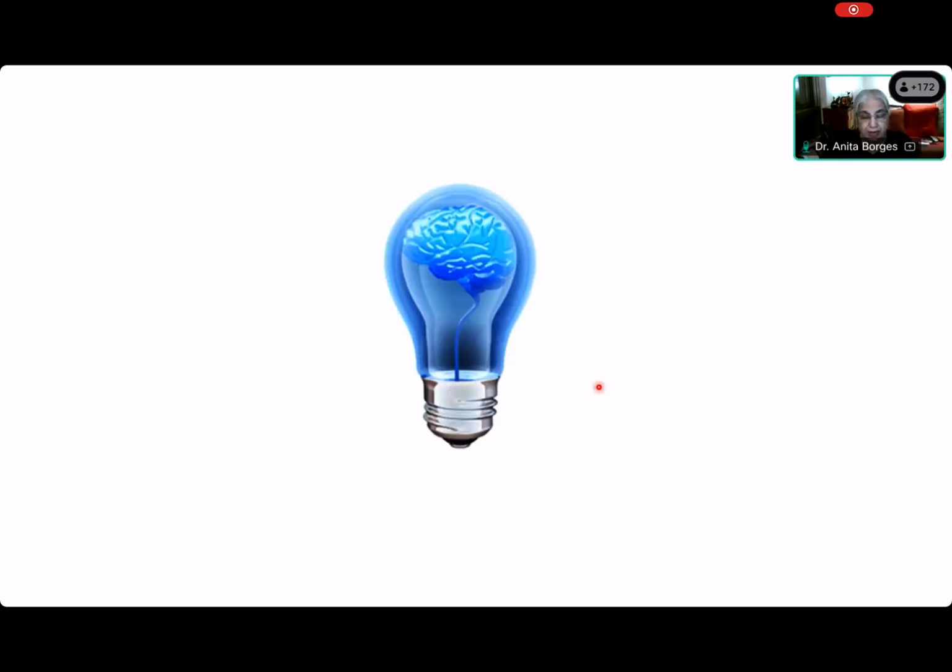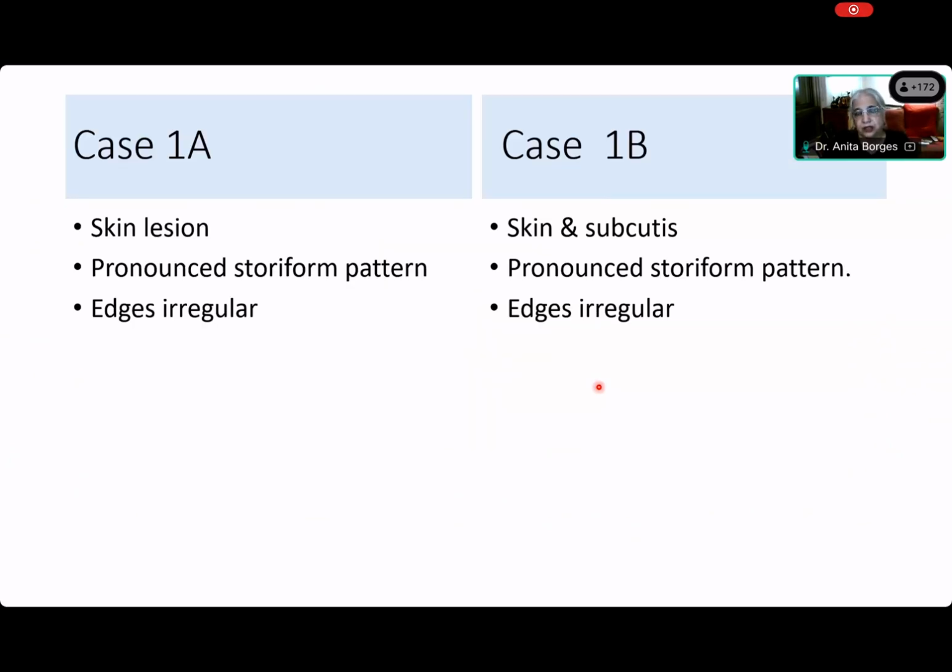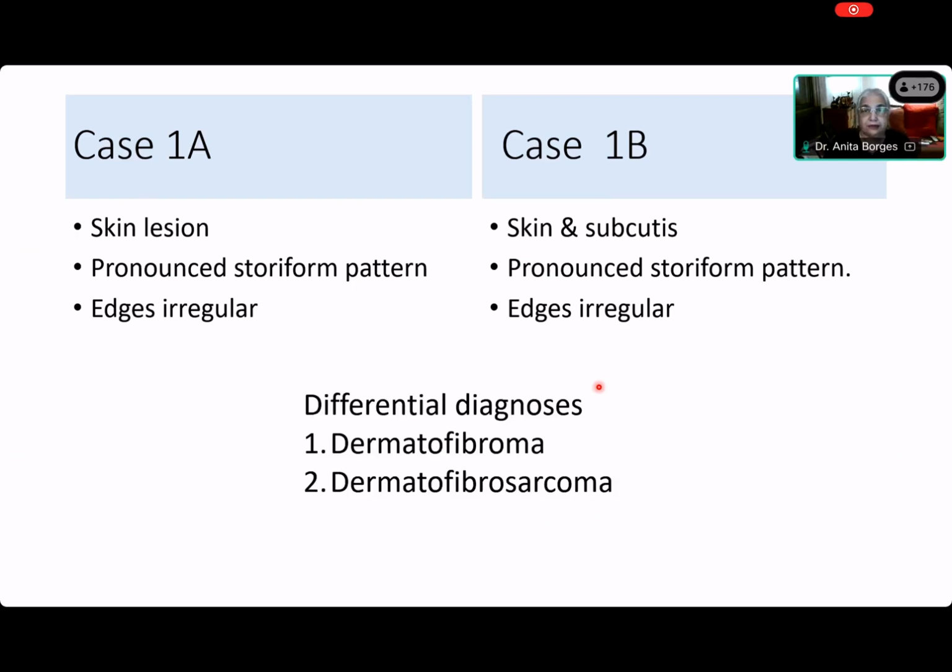So now what do we have? We have two storiform lesions. Both are in the skin. So case 1A and 1B. Saida, do you agree with this? They are skin lesions. Both have a pronounced storiform pattern. I didn't show you the edges, but I'm telling you that the edges are irregular. So now we have to do some thinking. So what is it? There are only two differential diagnoses.